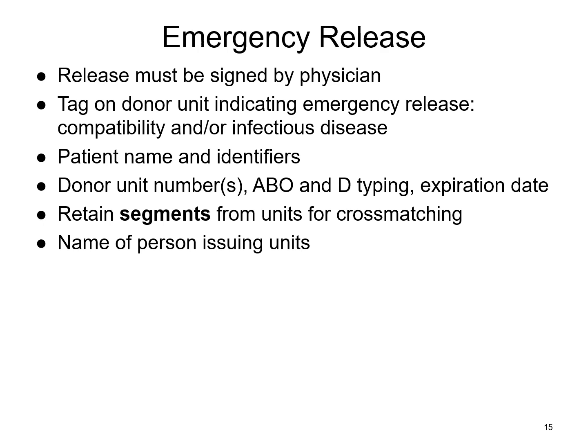And then of course you've got to have some way of documenting that you issued it, and when you issued it, because a lot of times if you're just doing an emergency issue and there's no patient information to tie that unit to, you're going to have to document everything on a downtime sheet, because depending on your computer system, your LIS that you use, there may not be a way to actually document it in the computer.